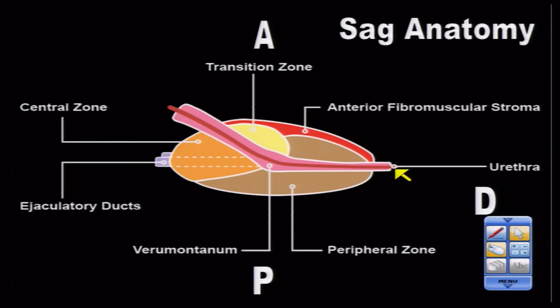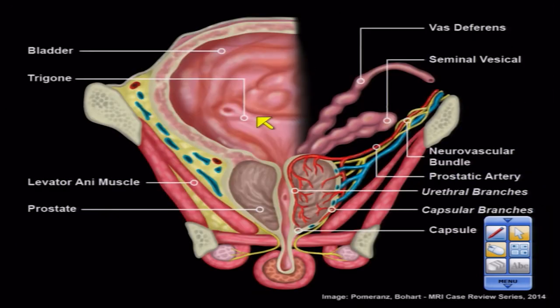Here is a sagittal projection lying on its side — this is the front — showing you the length of the anterior fibromuscular zone. With the patient lying on their back, this is the location where cancers are very difficult for the urologist to see and where MR is at its absolute strongest. Notice the peripheral zone goes all the way around and especially off to the side, forming almost a complete envelope around the central region. So you have to inspect carefully in the sagittal projection — all the way in the back, down and around, and all the way peripherally in the front. These parasagittal views can be very helpful but also a little confusing unless you understand the 3D anatomy.